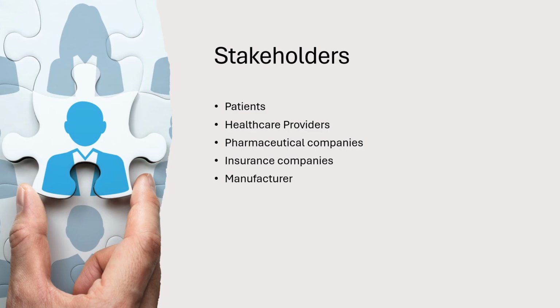The Dexcom ecosystem comprises an array of stakeholders, with patients at the forefront. Patients are the beneficiaries of the technology. Healthcare providers are also involved because they play the leading role in educating patients on how to interpret the technology whenever it gives an alert. They ensure that they also keep track on the progress of the patients and if an increase or reduction in medication is warranted.